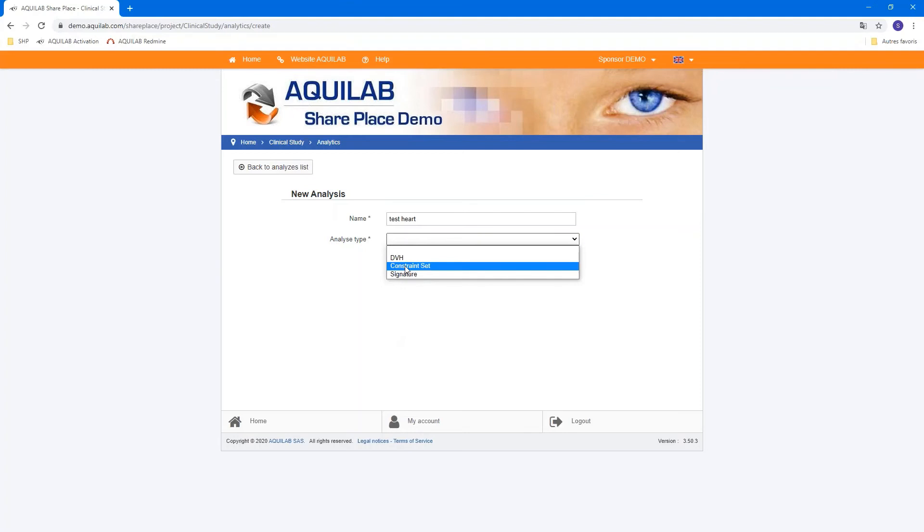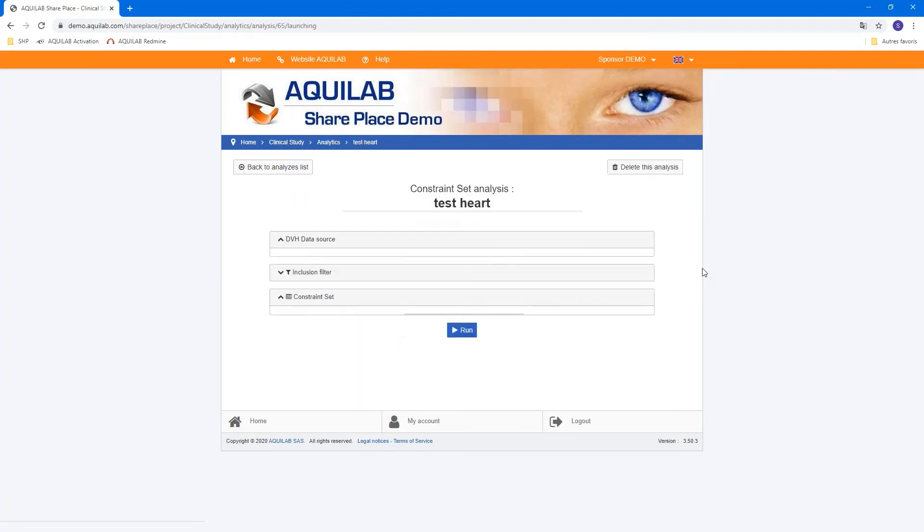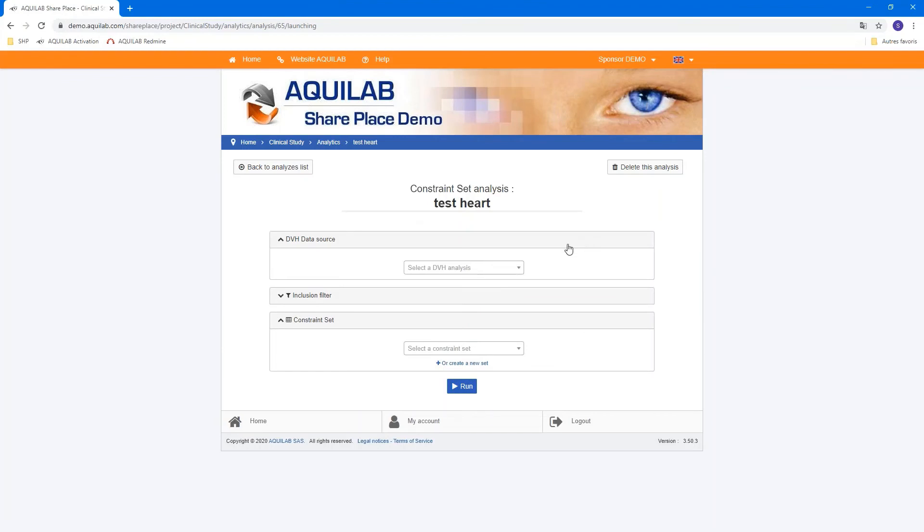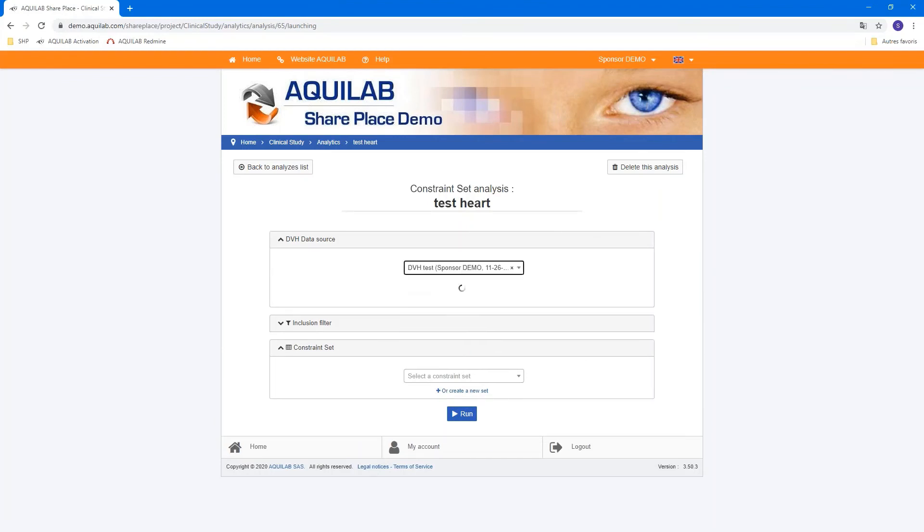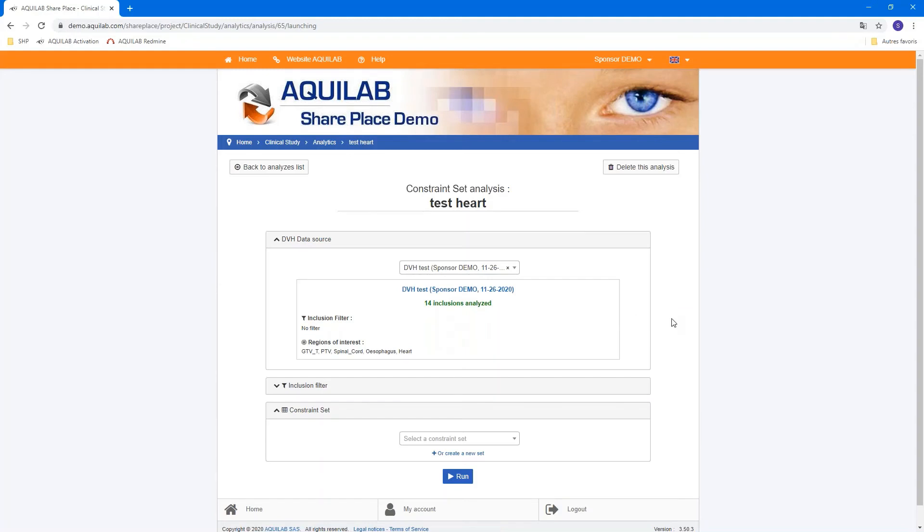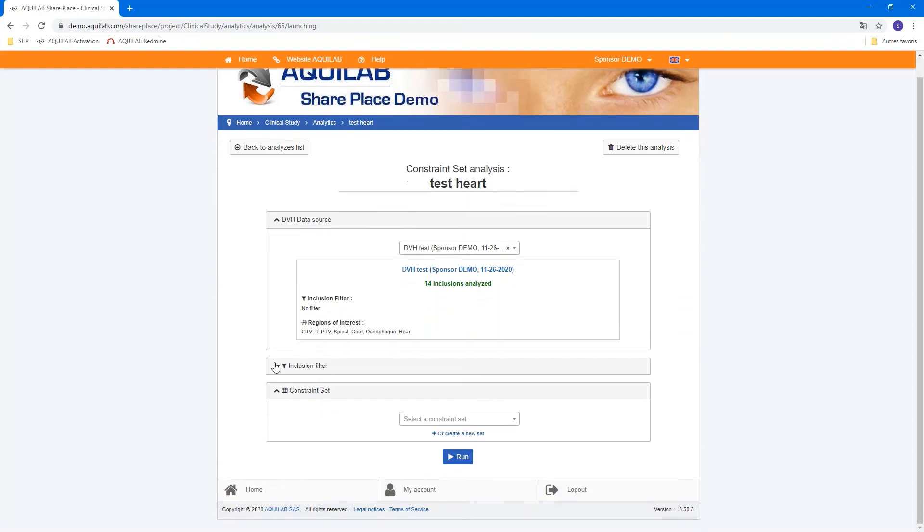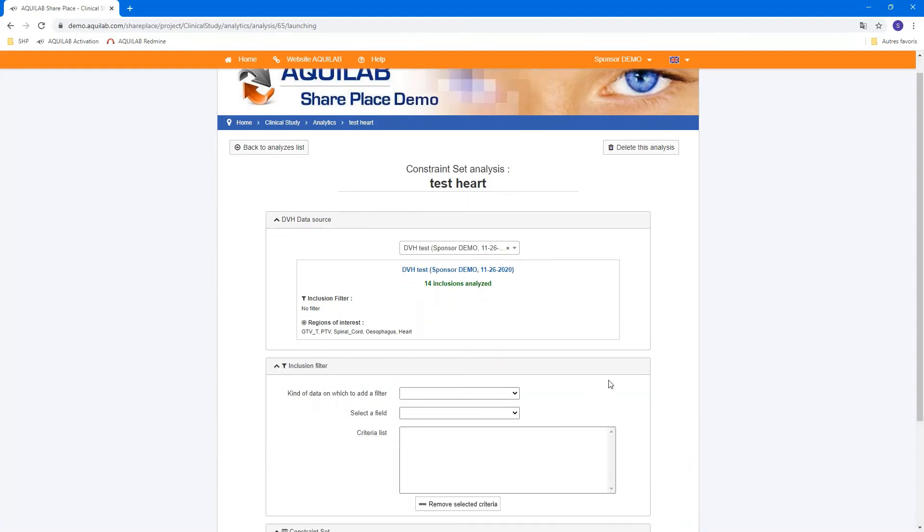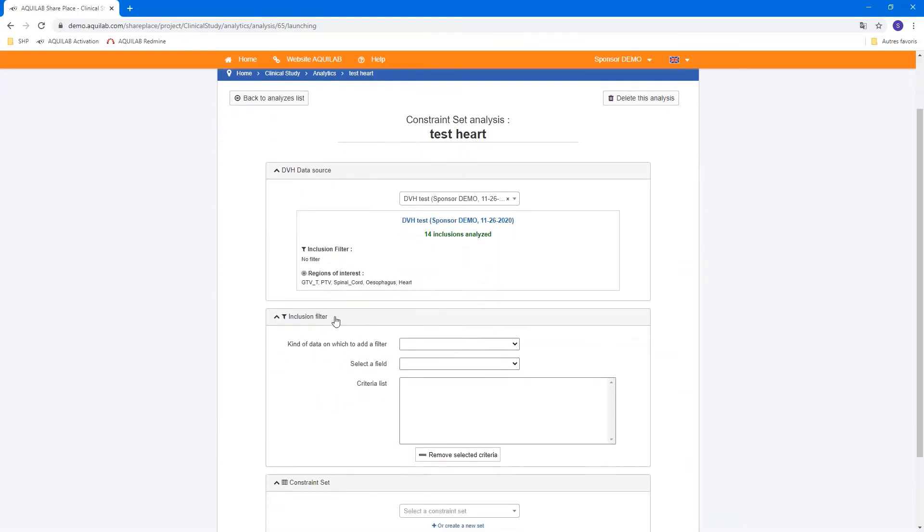We can go back to the main project and go to Analysis and create an analysis for this constraint. We select constraint set analysis type and create. You must choose a source of a DVH. In this example, we have fourteen inclusion analyzed and a summary of filter applied in this demo. You can add also a new inclusion filter if you need.